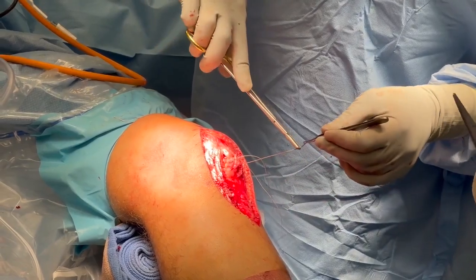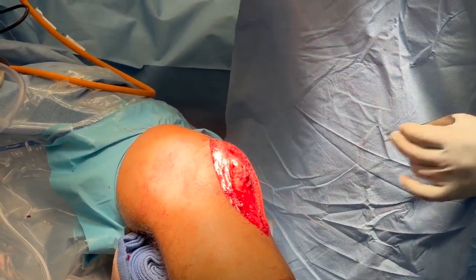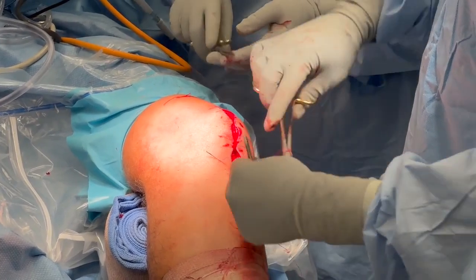The site of the patellar tendon debridement was closed with Vicryl sutures. The tourniquet was let down and the deep and superficial tissues were closed with suture.